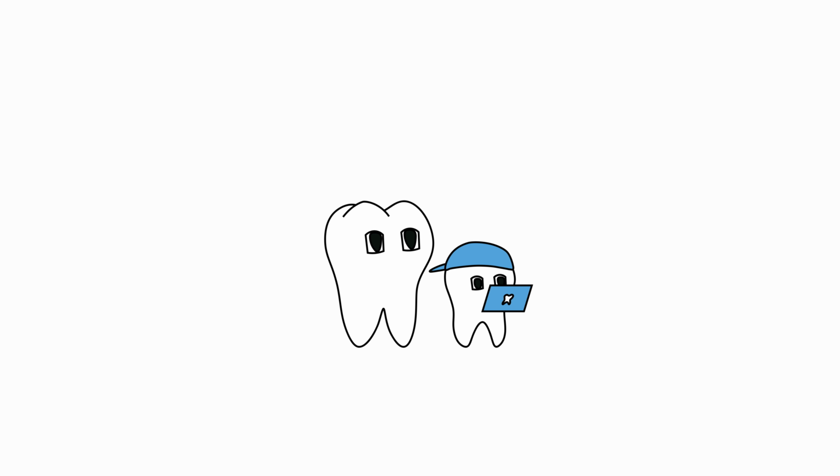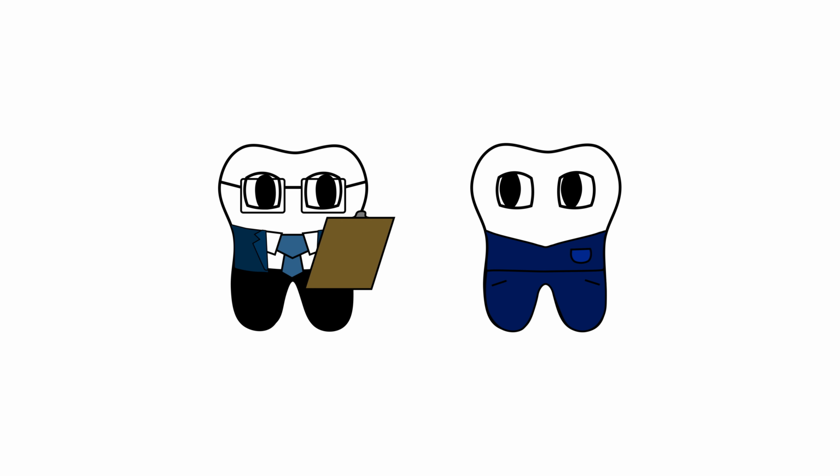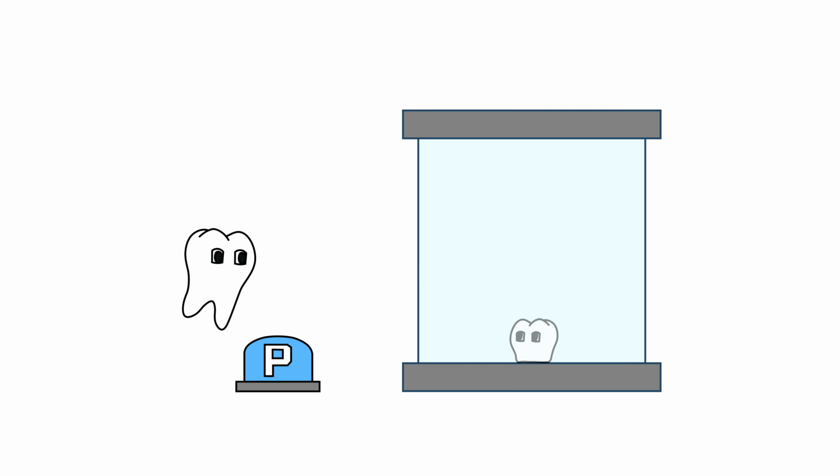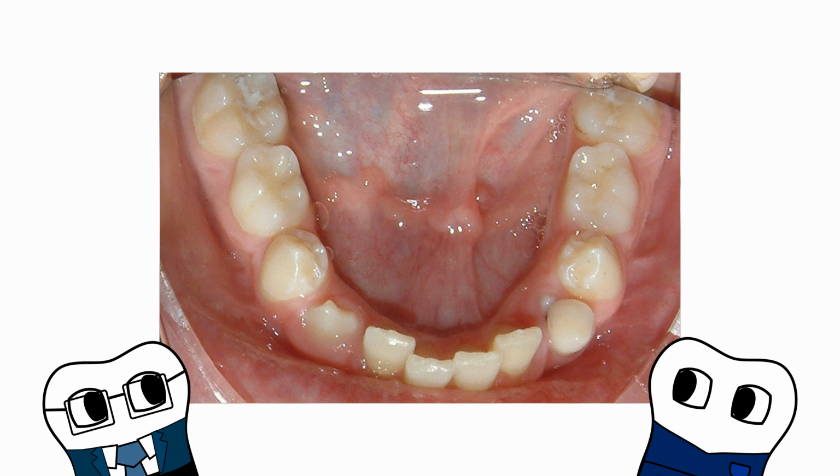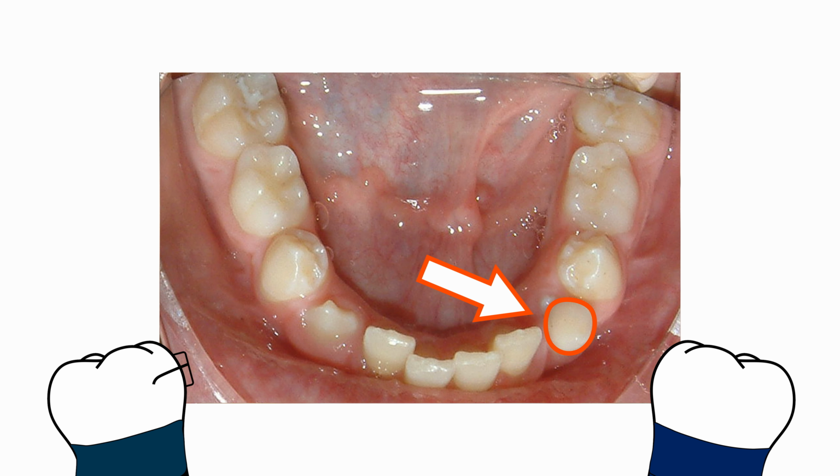So this is a much younger patient than we've seen before, but something that is required for general dentists to be comfortable treating patients at all stages of the life cycle. So you may notice that primary canine.